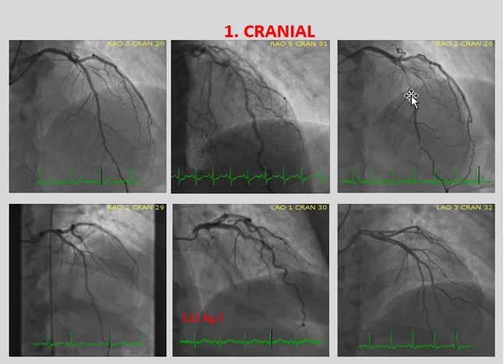If that vessel, which is a septal, were to branch off on its own, then you would only have changes in V1 and V2, as opposed to V1 to V4. I hope that clarifies a little bit of your ECG. It's always good to keep these things in mind. Let's move on to a different view now.